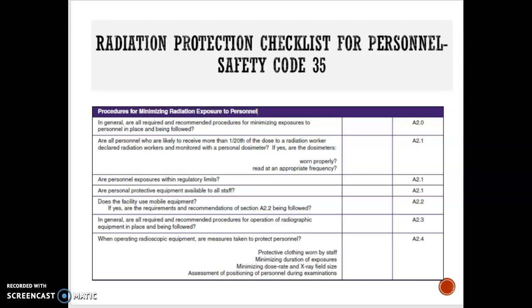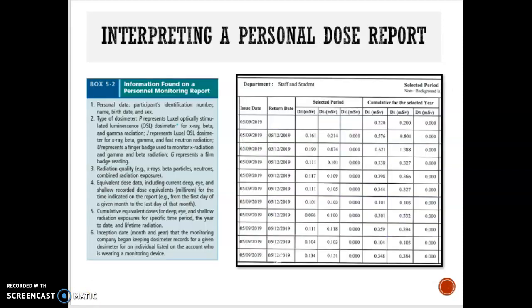Radiation safety survey reports are also generated to draw attention to any practices which could be detrimental to the patient or to the personnel working in the facility. Now, recommendations of improved or safer techniques are then made in cases where the potential risk is increased to the staff or the personnel. So when you are working in an X-ray department, you'll be wearing a TLD to monitor your exposure, or your dose, to your entire body.